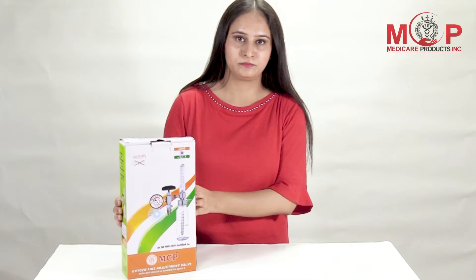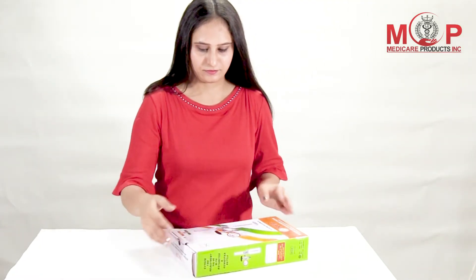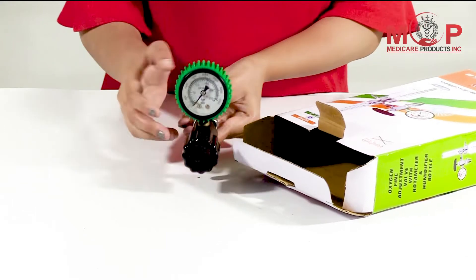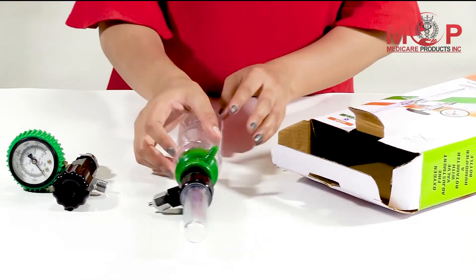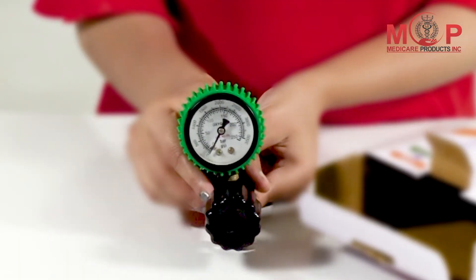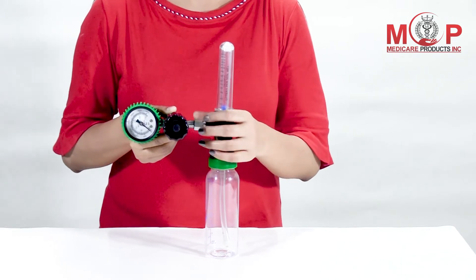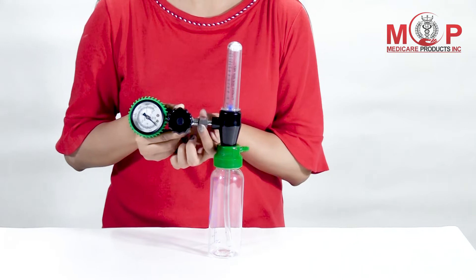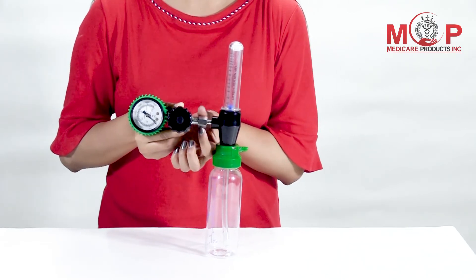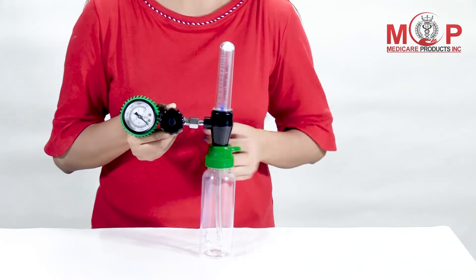It is suitable for B-type and D-type cylinders. It mainly consists of a gas pressure case, safety valve, flow tube, flow control valve, pressure reducer, and humidifier bottle.